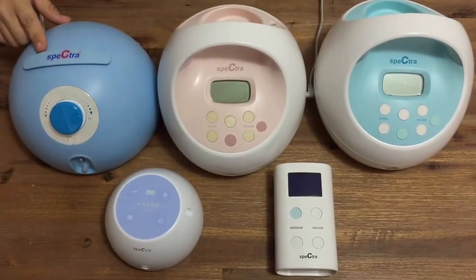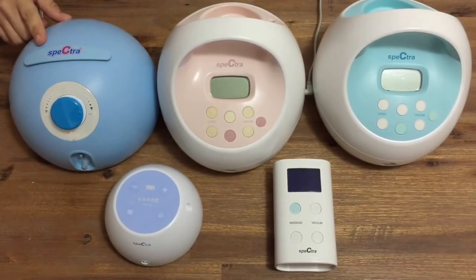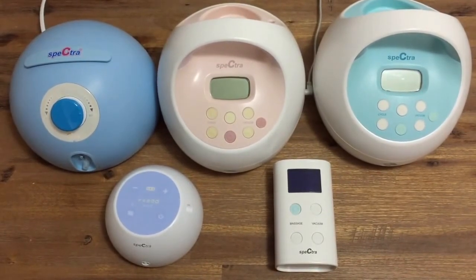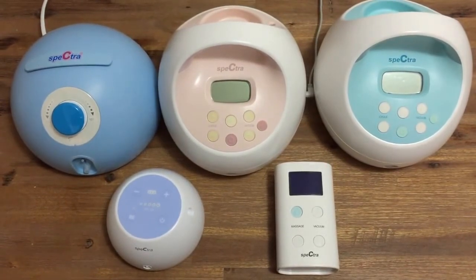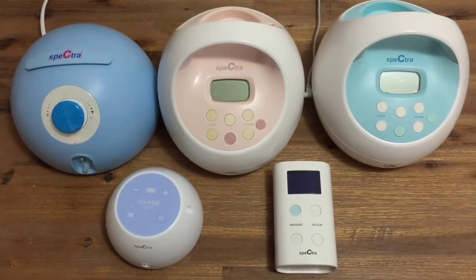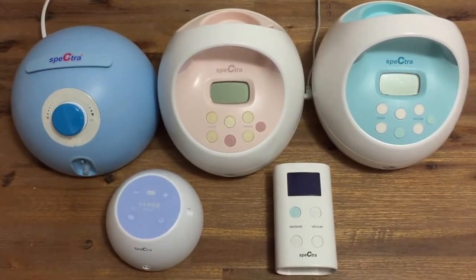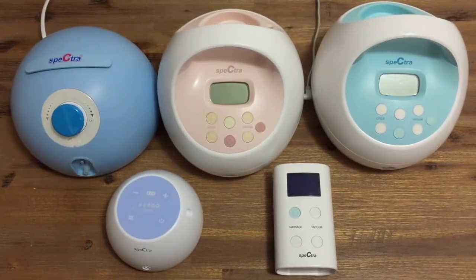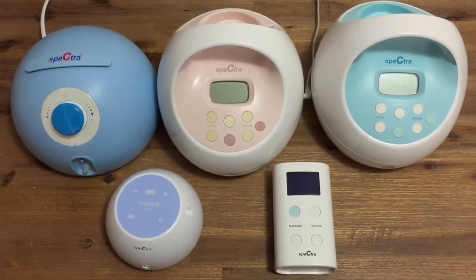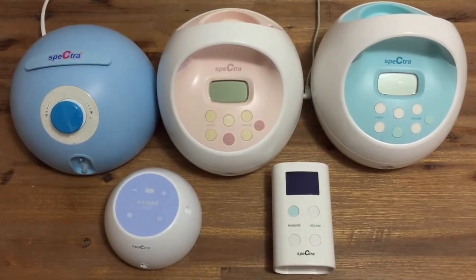Here is the Spectra G350 hospital grade breast pump. This is a very strong and quiet double breast pump and has the strongest maximum suction of all Spectra breast pumps. The cycle speed on the G350 cannot be changed and is set to 38 revolutions per minute. There is no let down mode on the G350 and there is no night light. Mums who choose the G350 do so for the strong suction and to support or establish their milk supply. It is the cheapest hospital grade breast pump available and very effective.